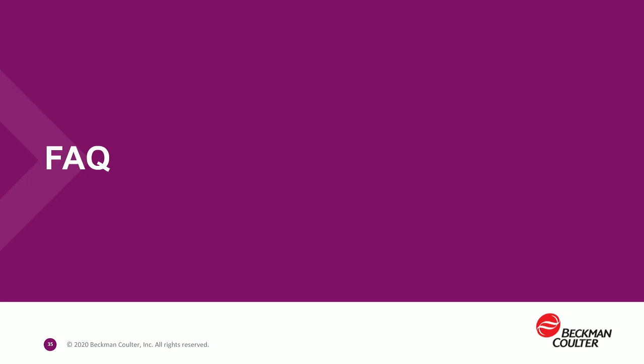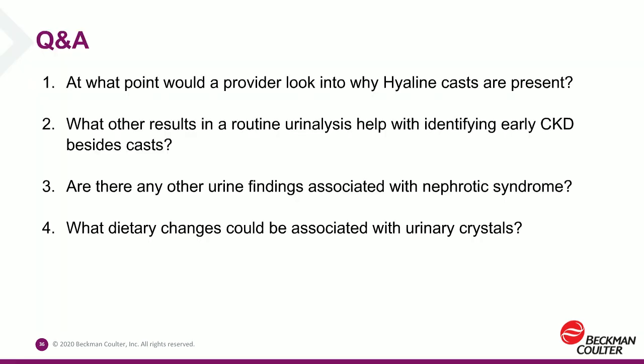Now we'd like to go into a few frequently asked questions. So Dr. Ness, question number 1. At what point would a provider look into why hyaline casts are present?